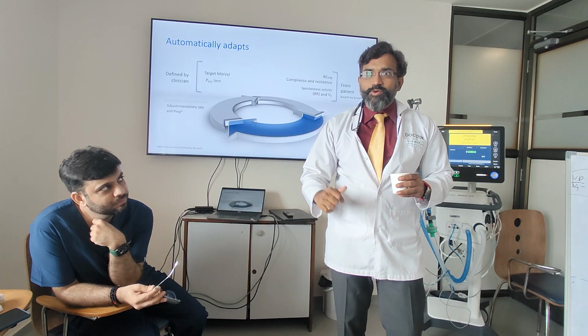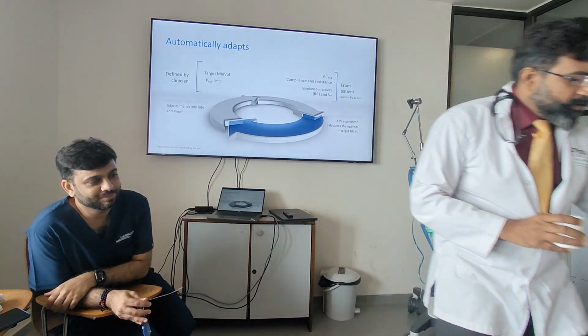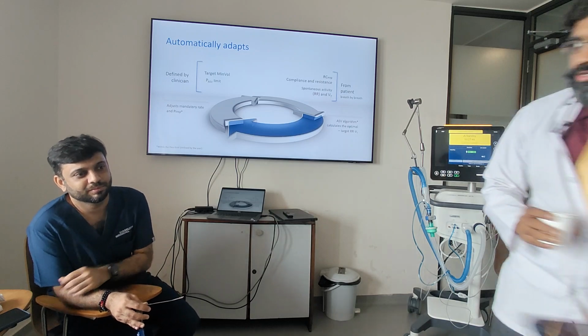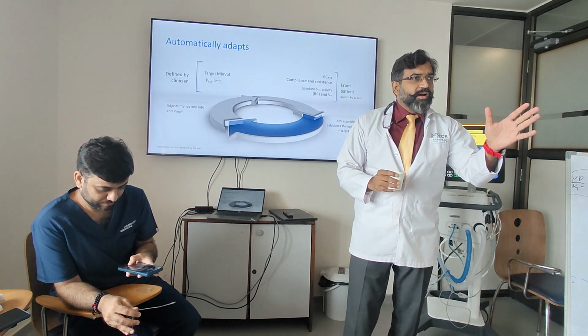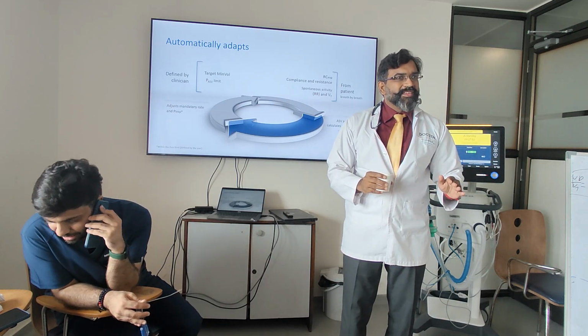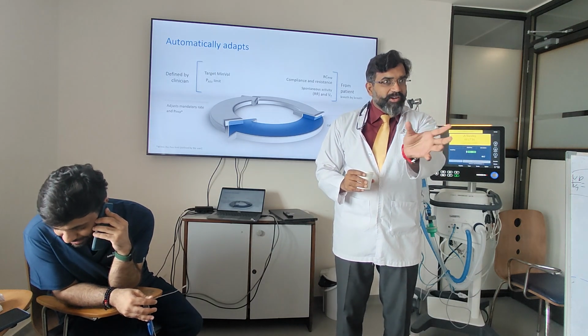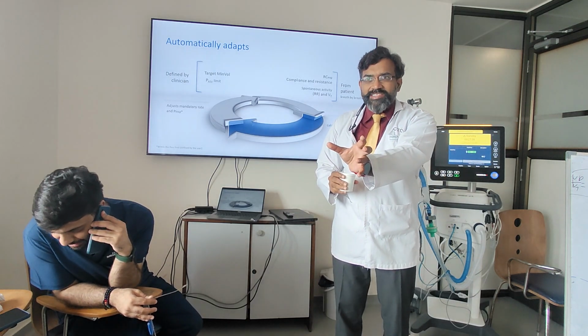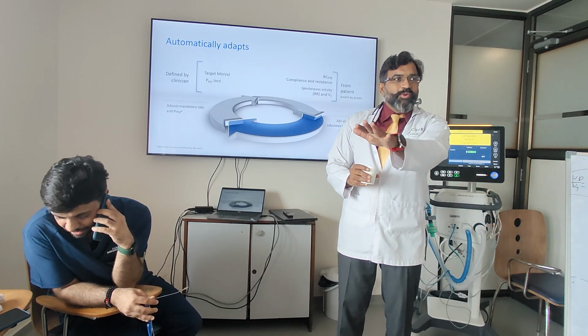Now what does this ventilator do? This closed loop is so beautiful that if the RR goes up, it will convert from volume control to pressure control. It will immediately convert the mode directly. Are you understanding? If the RR goes low, it will convert to volume control.